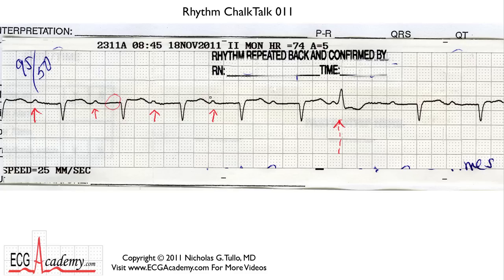So let's start to measure intervals. We take the beginning of the P wave on this heavy line, and you can see the PR interval is about 400 milliseconds. Pretty long, and since it's greater than 200, we call it a first-degree AV block, and it looks to be pretty constant.